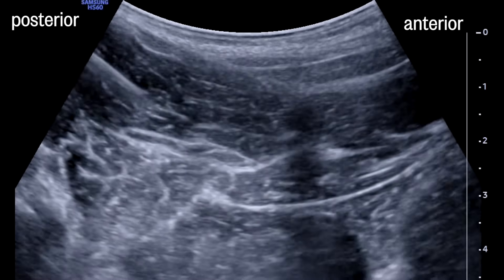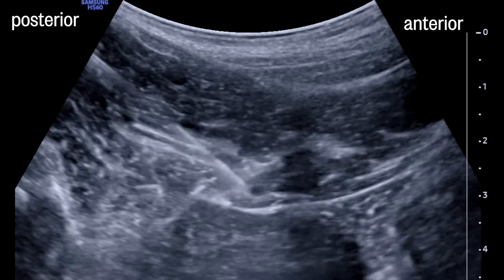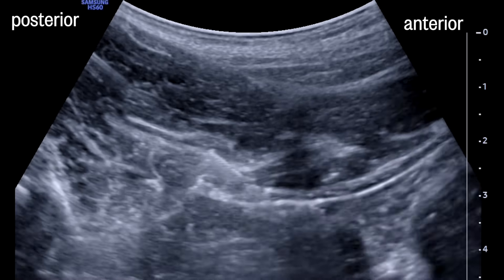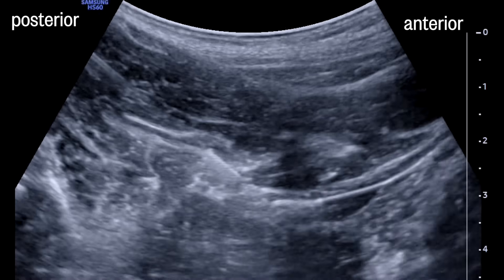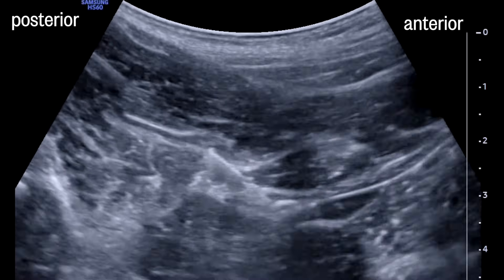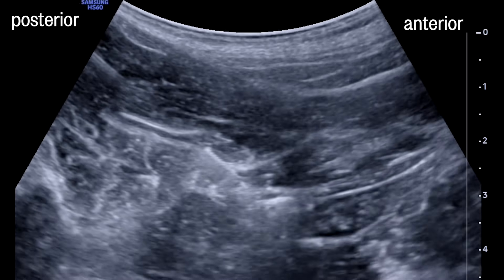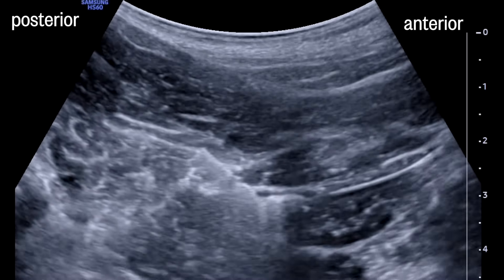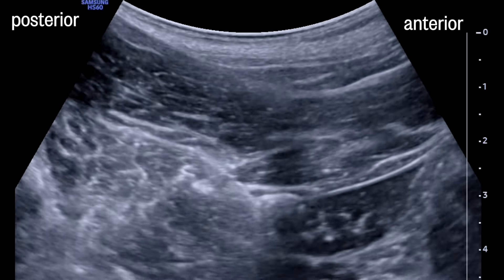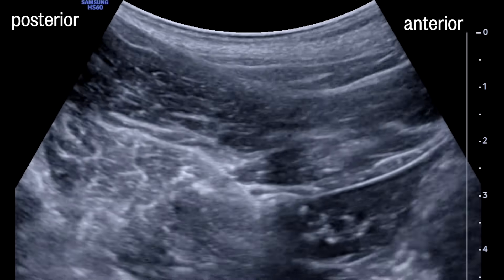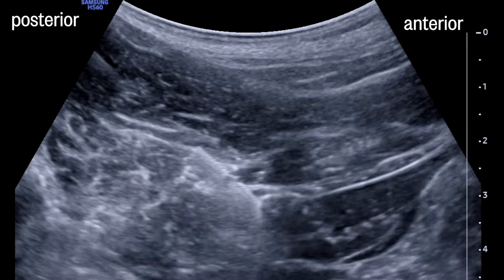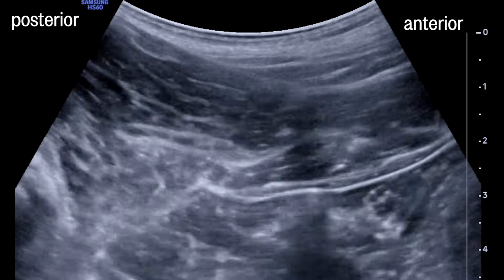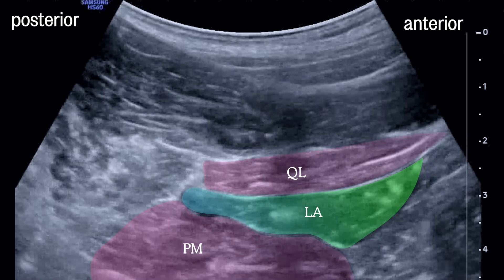Let's see this block. We see the needle passing through the erector spinae muscle, then QL. After a pop through the deep surface of the QL, a test injection with saline shows that we're in the right plane, and the psoas muscle starts to be pushed down and peeled off the underside of QL. You can see the local anesthetic swirling in the potential space being created between the QL and psoas. There is some lateral spread, but the elastic recoil of the poorly compliant muscles in this part of the trunk will help to squeeze the local cephalad. You can see the retroperitoneal contents moving with respiration, just lateral to the needle position. It's important to ensure that the needle tip is truly between the QL and psoas muscles — and not between QL and the retroperitoneal fat — for the block to be effective. Here we see the local anesthetic has pushed the two muscles apart nicely.